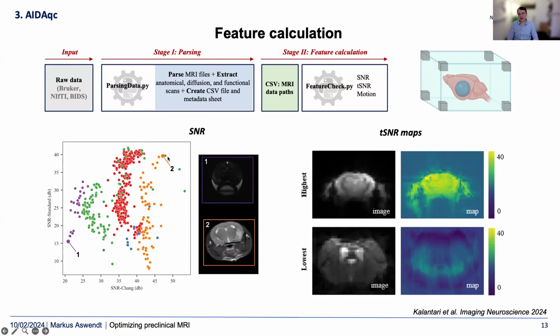Okay, for TSNR, as humans it is rather difficult to see, because from the real image you don't see it exactly. You need the time series. And as a T map, so to say, of the SNR, you see it much better. And this is also what the algorithm is using.